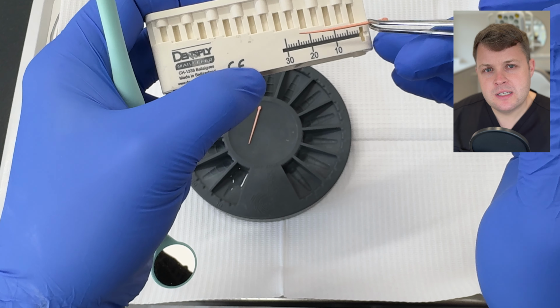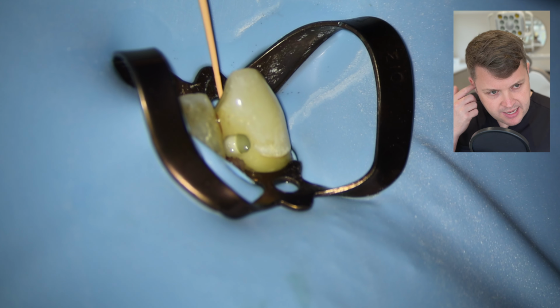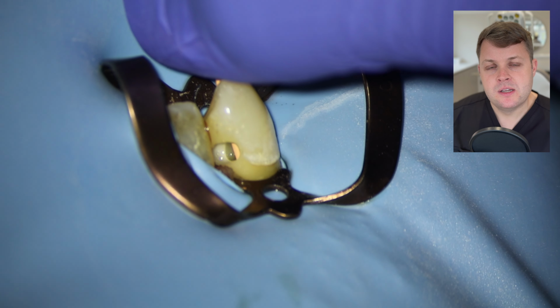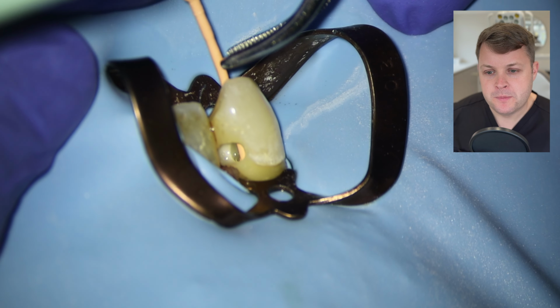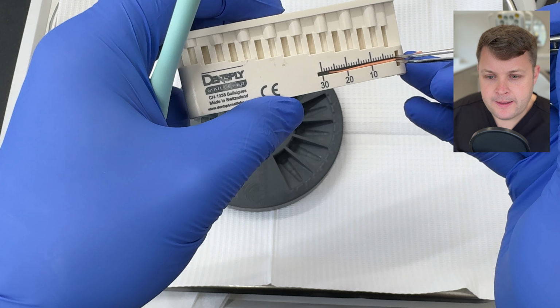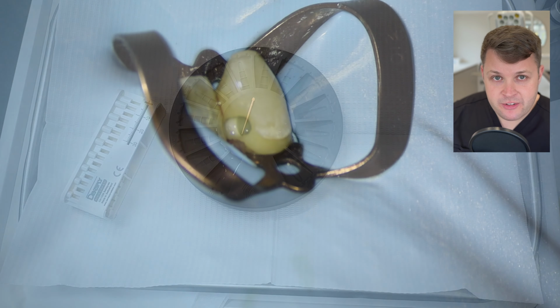But actually, what you'll notice is sometimes when you splice these GP cones together and then place the GP cone into the canal space, it doesn't actually reach to the zero reading. You might ask yourself why that is, and that's because the taper on this GP cone is too thick. Because you've spliced the two GP cones, you can see here that the GP cone is short, and the thickness of the cone isn't able to reach through the thickness of the canal space. So what you do is give it a little bit of an extra roll.